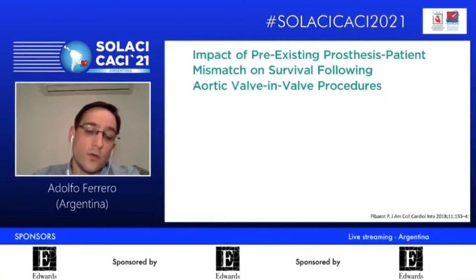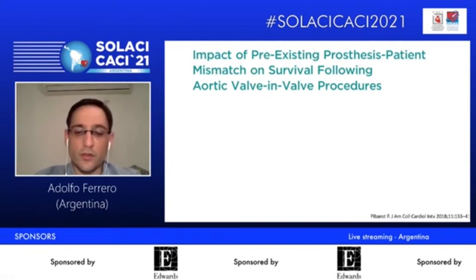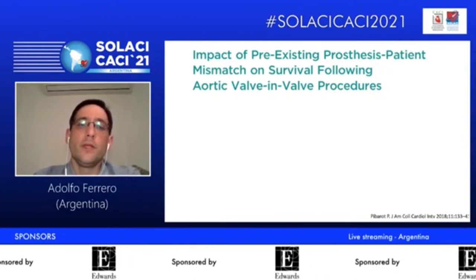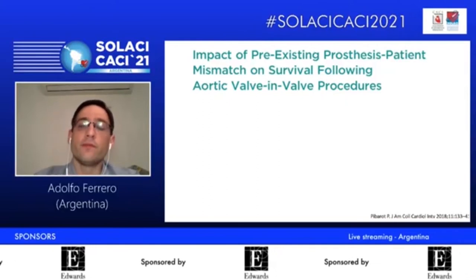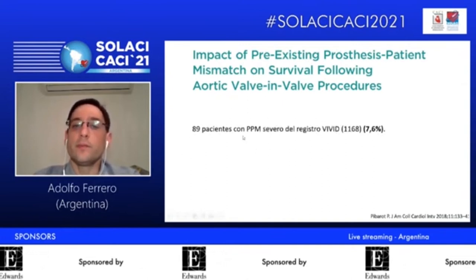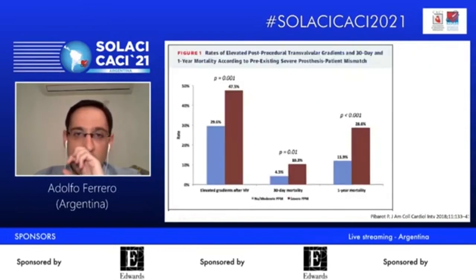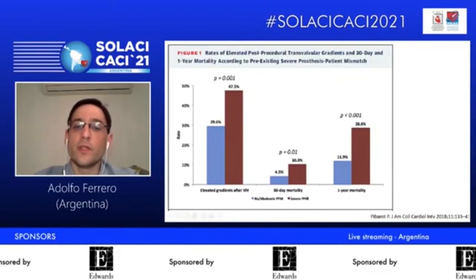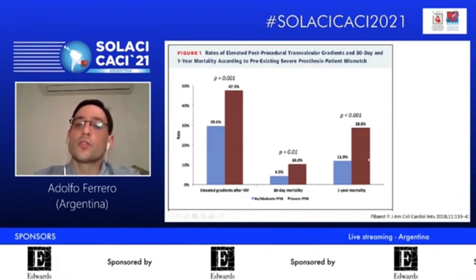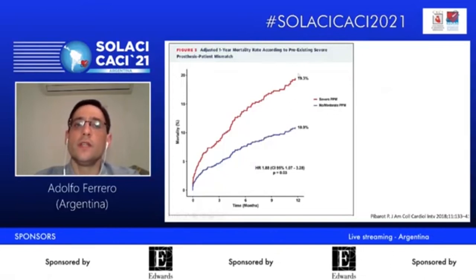The same as this trial of Philippe Pibarot, who is with us today, and we must say thank you because he did a lot for the science. The impact of pre-existing PPM on survival following the aortic valve-in-valve procedure. He took almost 90 patients with severe PPM from the VIVID registry, which is more or less 8% of the patients. And he said that the mortality of patients with severe prosthesis-patient mismatch in this field, the valve-in-valve, has more mortality at 30 days and also 1 year later.